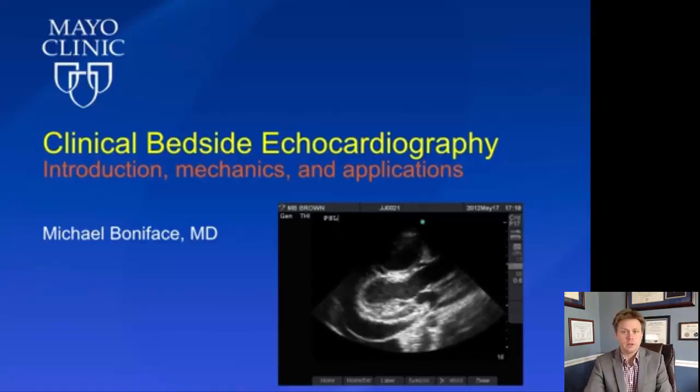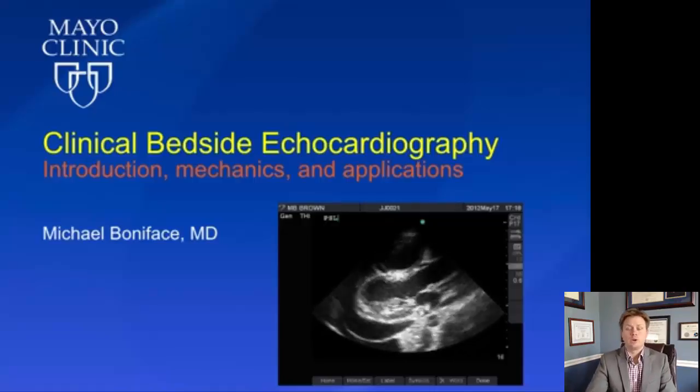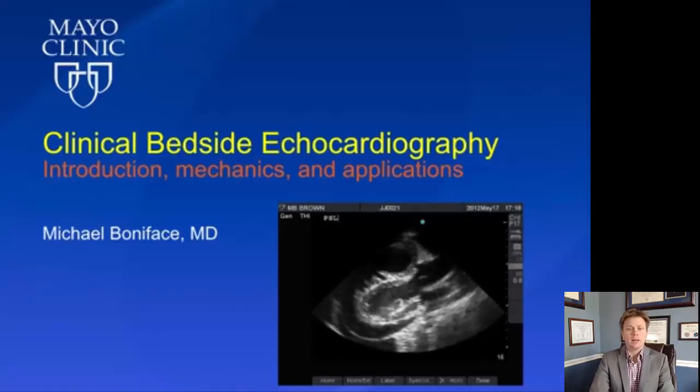Today we're going to be continuing our series on an introduction to bedside ultrasound, talking about clinical bedside echocardiography. We're going to talk about some of the indications for these studies, the different mechanics and image acquisition techniques, and some of the clinical questions that you can be answering in your daily practice.